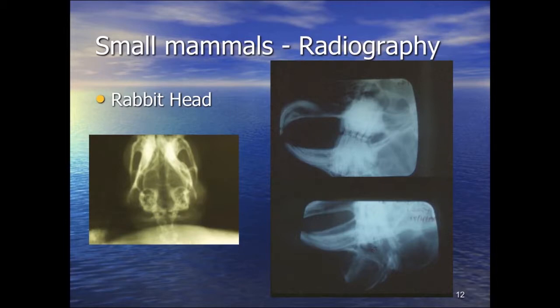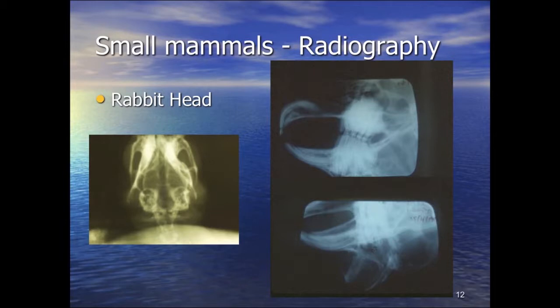On a close-up dental radiography film we can see the fine detail: increased sclerosis here leading up to the horizontal canal, loss of trabecular detail — trabeculi within that bulla that you can see on the normal side have become bitty and pointy here, with a general infill going on in that particular bulla. Middle ear disease and dental disease can take many different forms. In long-standing cases we actually get bone deposited — long-standing soft tissue abscesses, particularly in the lower jaw, will often stimulate bone production. The rabbit tries to wall off the abscess to contain it — rabbits have a slightly different strategy from carnivores, which tend to produce an abscess that comes to a point and ruptures. Rabbits tend to just wall the thing off.